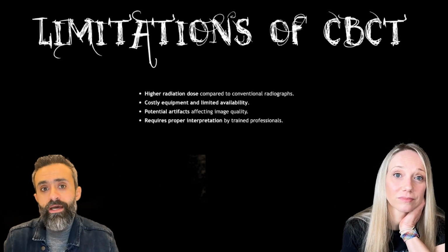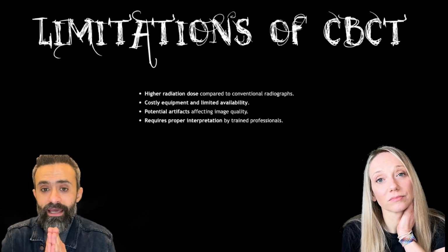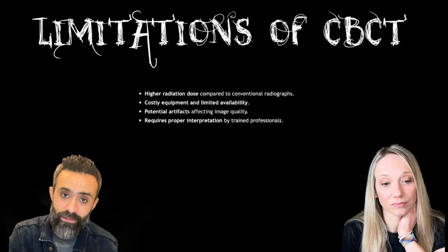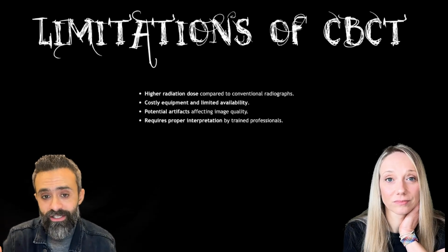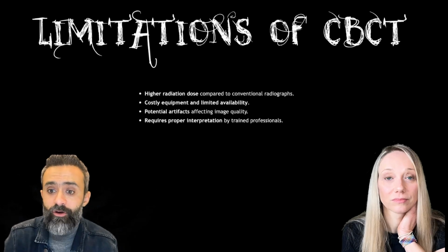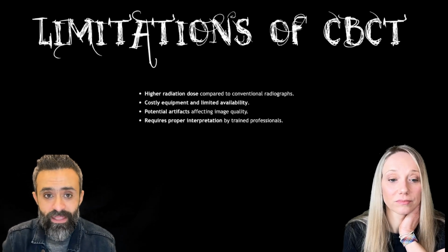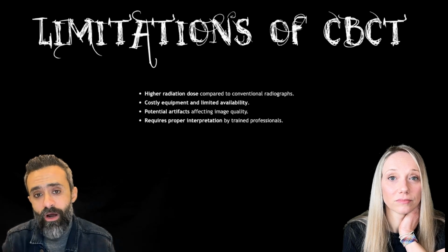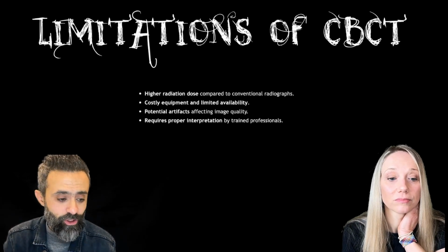In conclusion, we have to say that CBCT is a wonderful tool, but every scan has its own limitations. There is no perfect scan. So as Francesca said, we sometimes have scattering and metal artifacts that can compromise our visualization of the details, and we still have resolution problems in the currently available CBCTs, even with a high resolution.